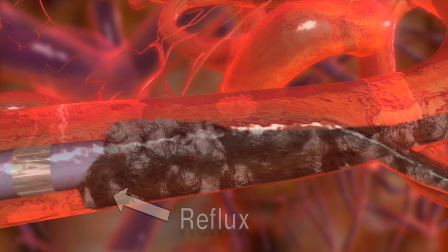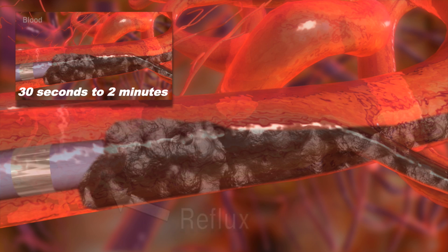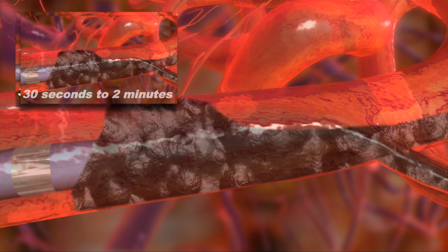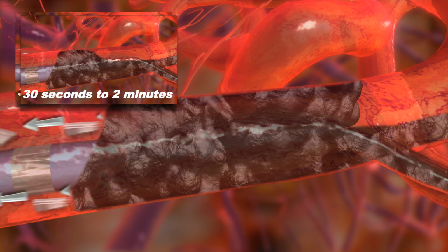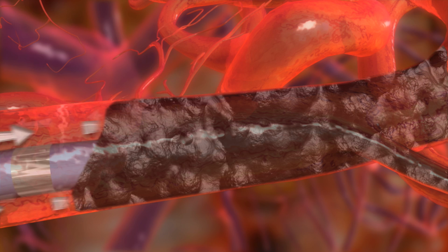The moment reflux is detected, stop the injection for a duration of 30 seconds to 2 minutes, allowing the ONYX to solidify at the site of reflux. Do not exceed 2 minutes. Resume the ONYX injection until reflux is again observed. This should create a plug around the catheter tip. This is known as the plug and push technique. Once a plug is established, ONYX will easily penetrate the nidus, filling the lesion.